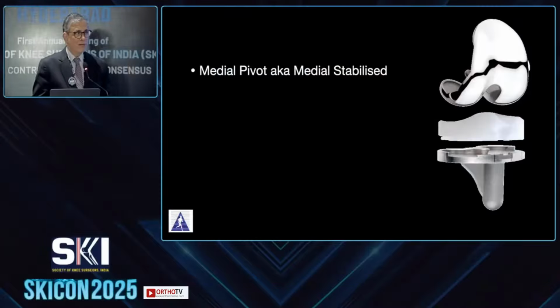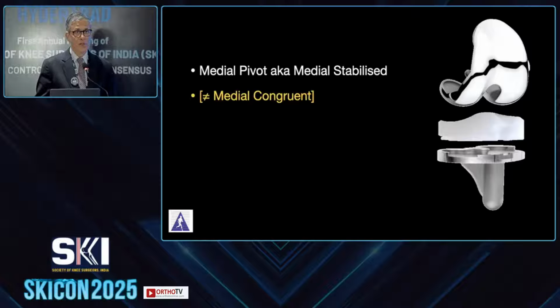As we've discussed, there are different ways to treat the same problem. The medial pivot or the medial stabilized is the one category of implants which should not be confused with the medial congruent. I'm going to be discussing the medial pivot. The medial congruent is in between the CR and the medial pivot, and that is not what I'm going to be discussing.